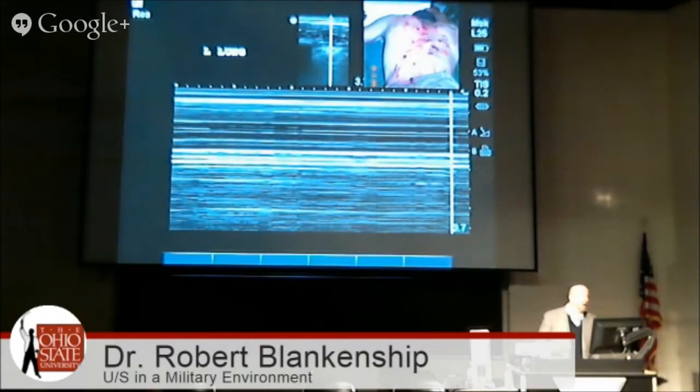Does your chest hurt? Yeah, I think it does. I got 50 holes in my chest. Right? You having a hard time breathing? Yes, it hurts. And before we acquired it, which is a military term for stole, those pulse oximeters from the combat support hospital, we had no pulse ox, so you can't rely on that. With ultrasound, I can tell you if this guy had a pneumothorax or not.